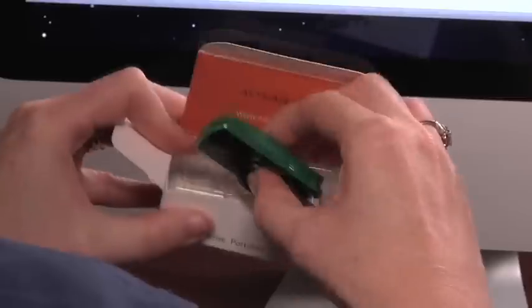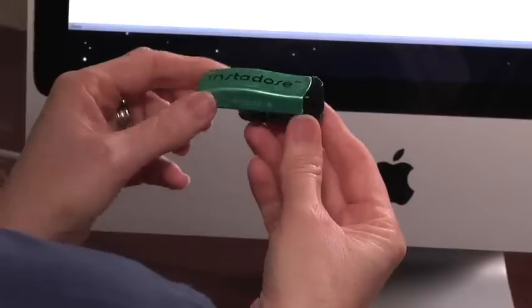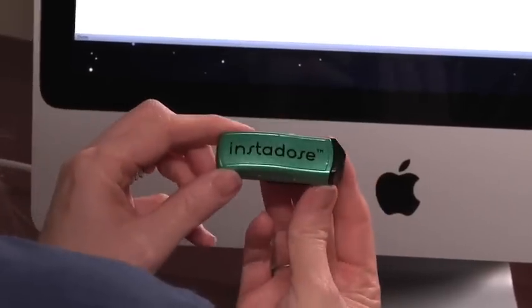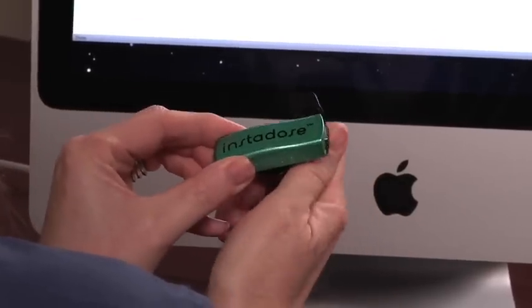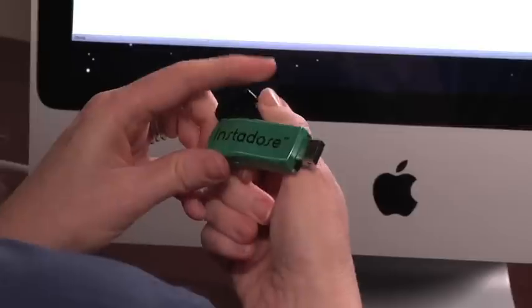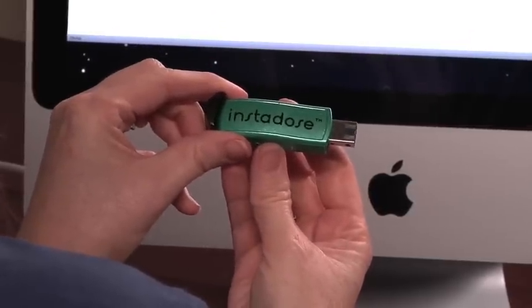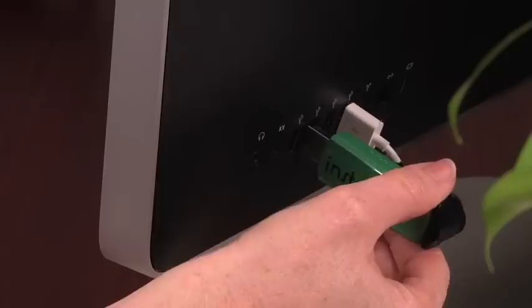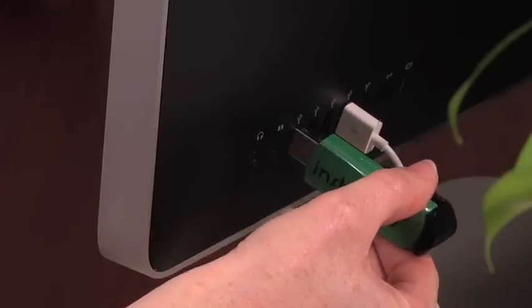To open the InstaDose Dosimeter, hold the clip and turn it 180 degrees to either side to extend the USB connector. To register and initialize your device, begin by plugging it into a USB port.